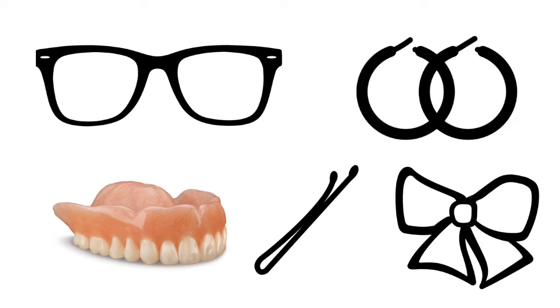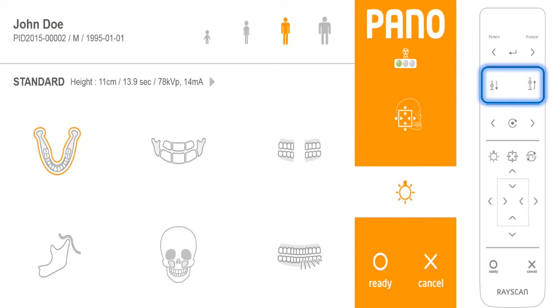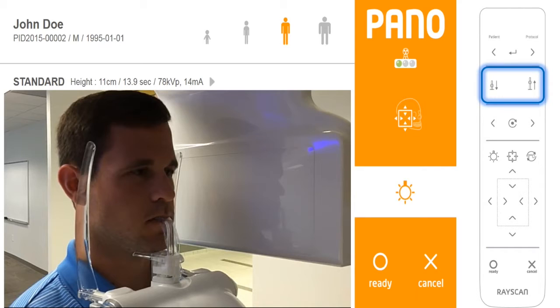Prepare the patient. Ask the patient to remove glasses, dentures, jewelry, hair clips and pins. Place the protective lead apron over the patient's shoulders. Press the up and down buttons to adjust the height of the chin rest so it is slightly higher than the patient's chin, so that the patient will have to stretch up to place their chin on the chin rest.